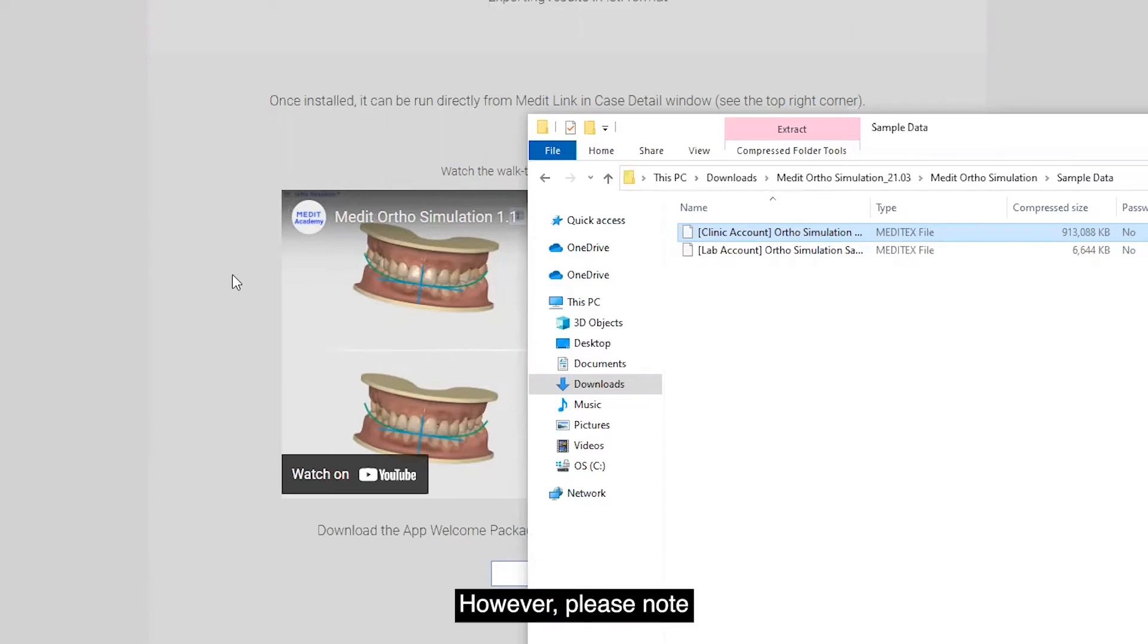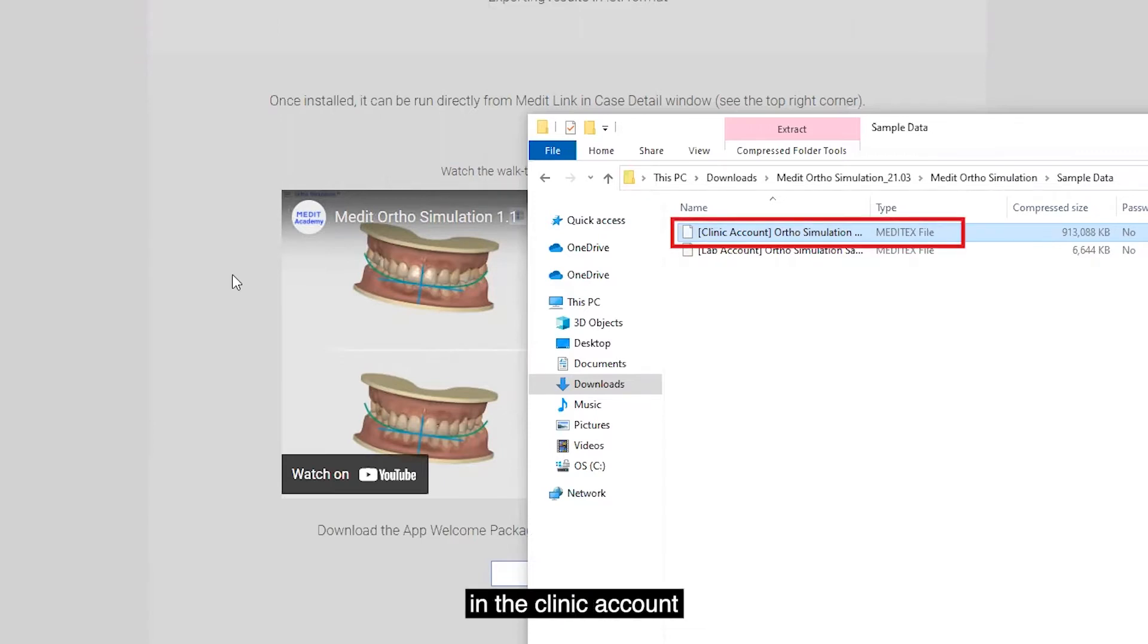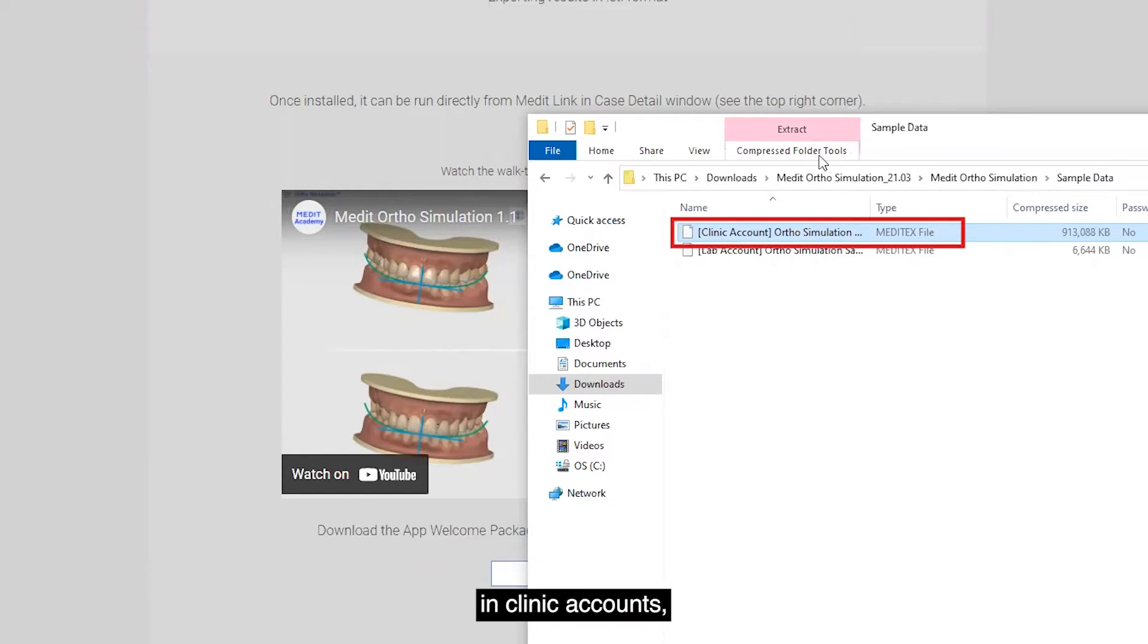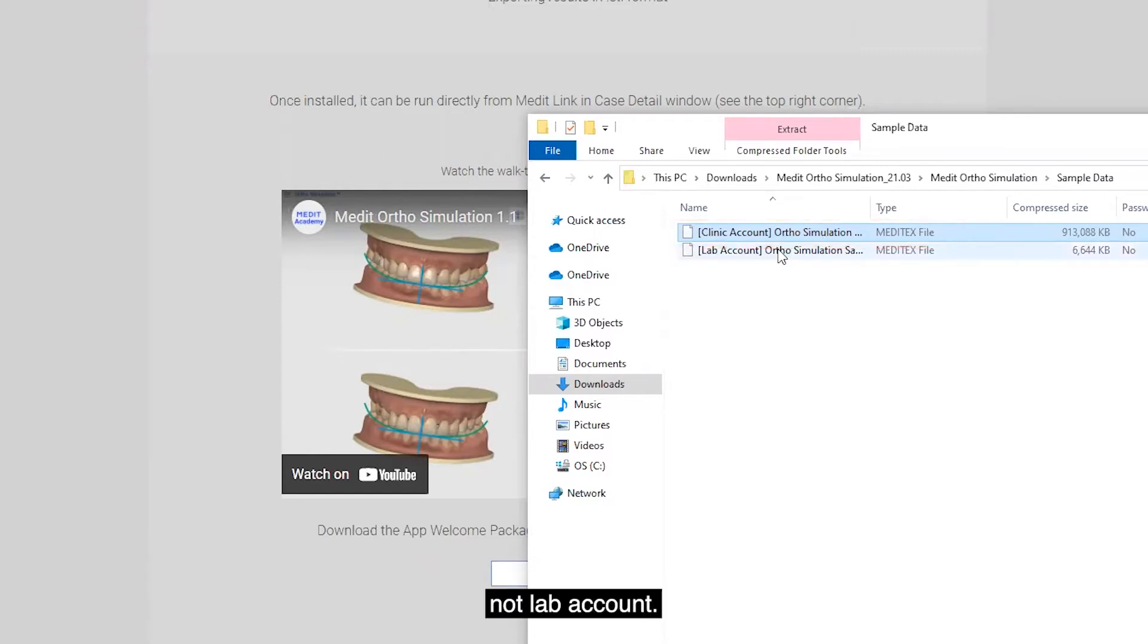However, please note that the file was created in the clinic account only allows import in clinic account, not lab account.